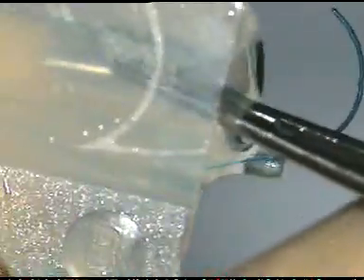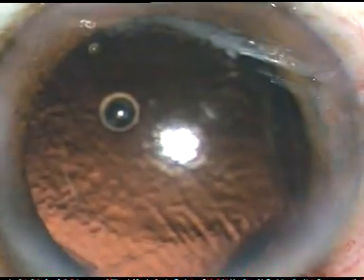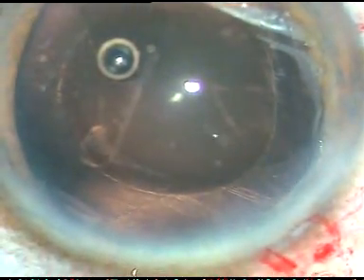And this is the multipiece intraocular lens. It is being loaded in the cartridge. And I push it. Now see what happens when I push the piston — it pushes the haptic. So I lift this haptic with a Szynski hook. And I ask my assistant to advance the piston like this. And this is a nice technique. If we don't do this, we are going to damage the trailing haptic. Now here I am going to implant this multipiece hydrophobic intraocular lens in the sulcus.